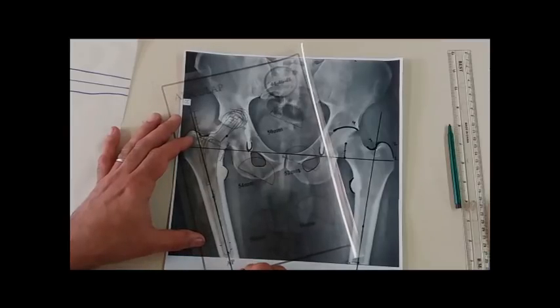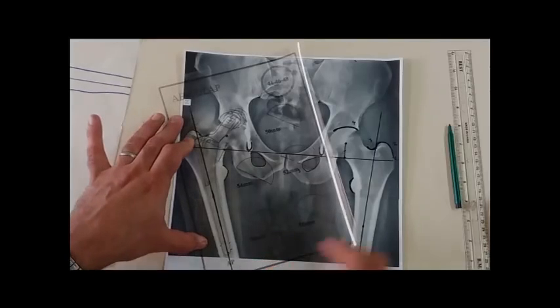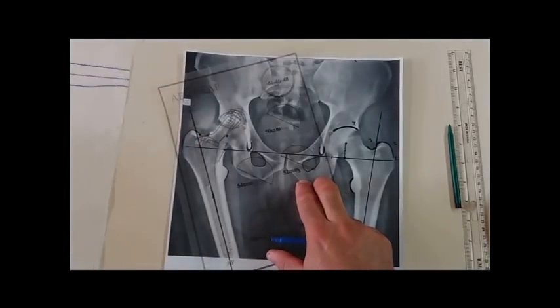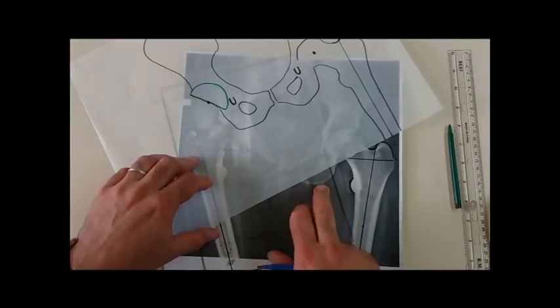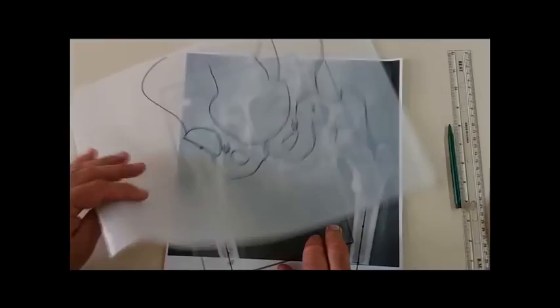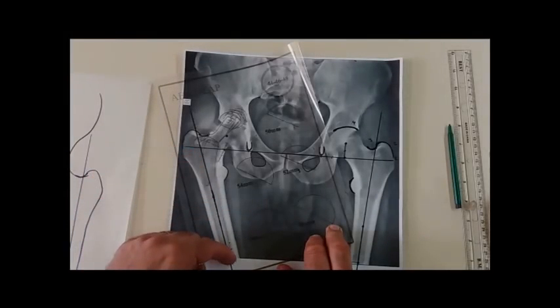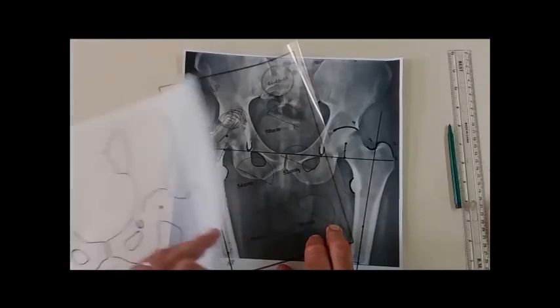For example, of this, I am satisfied that it is 12, it is cementless, and I will fix this transparent template to the radiograph and bring my tracing paper. What I will do in this tracing paper, I will try to compensate also, as I mentioned, for adduction of the hip, of the femur. How can I compensate? By this tracing paper.